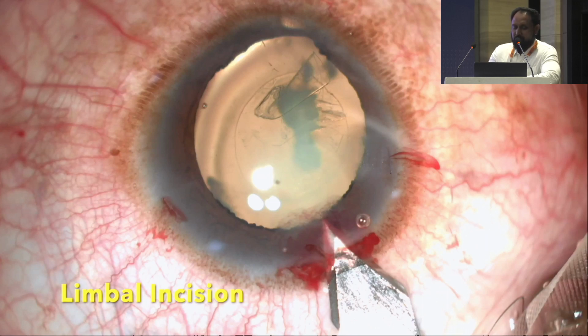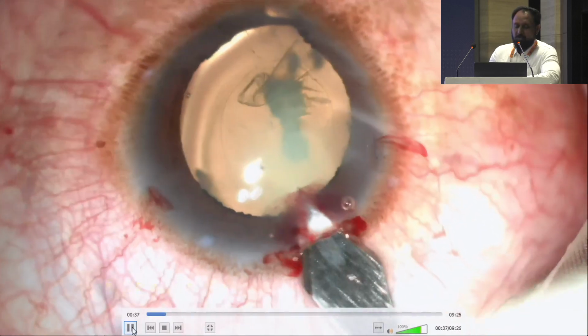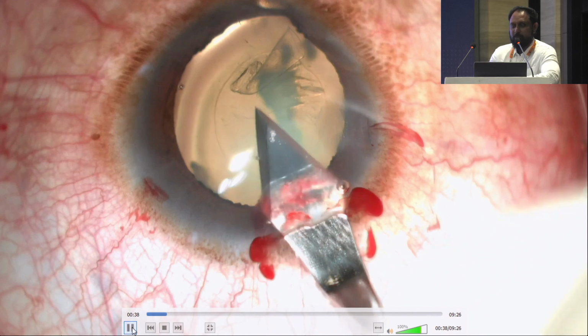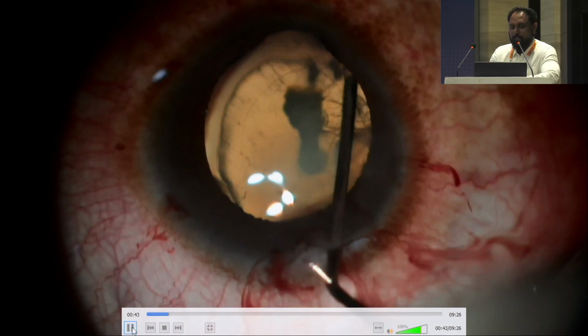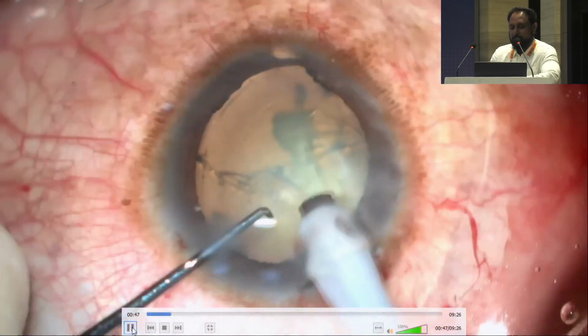So this incision helps me in the harder cataracts because in case you have a nucleus tilting or something and you want to extend, a limbal incision is better and safer to extend than a pure clear corneal incision. So that is why this incision. Doing a gentle hydro, as you can see the movement of the lens is there. So just make sure we get a good separation.